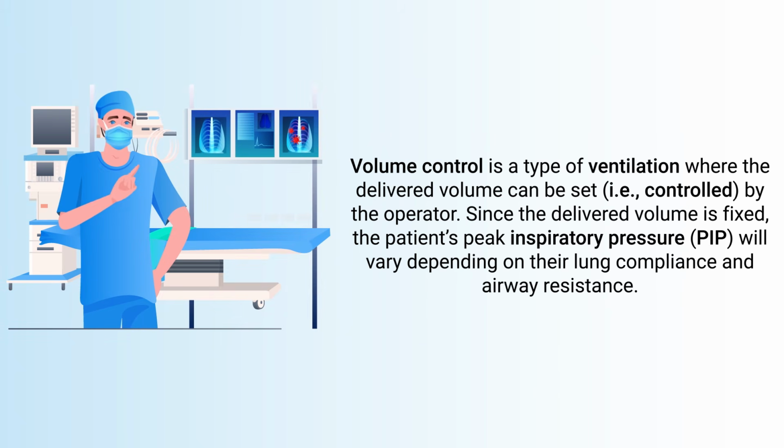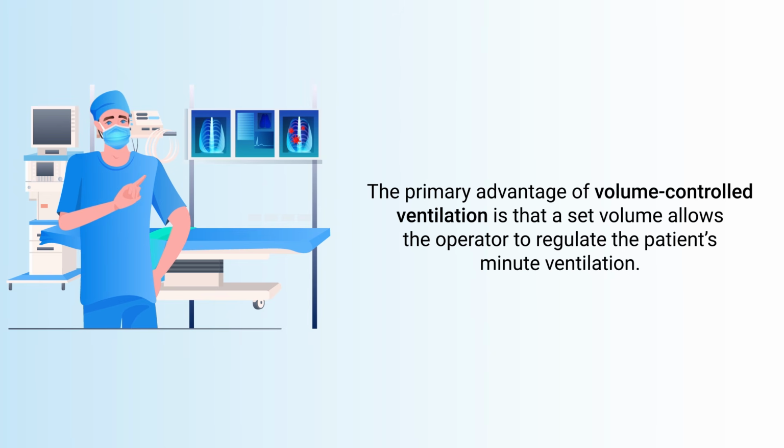Volume control is a type of ventilation where the delivered volume can be set or controlled by the operator. Since the delivered volume is fixed, the patient's peak inspiratory pressure will vary depending on their lung compliance and airway resistance. The primary advantage of volume-controlled ventilation is that a set volume allows the operator to regulate the patient's minute ventilation.